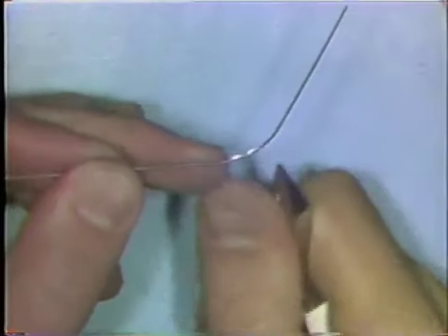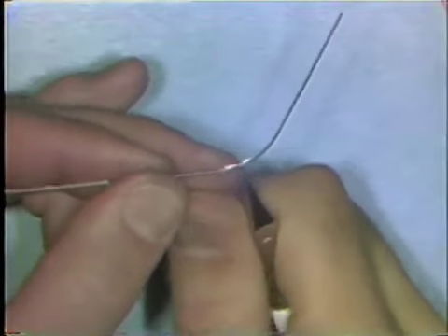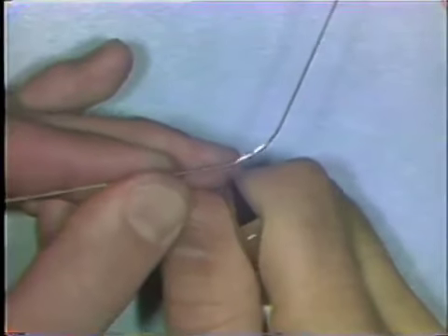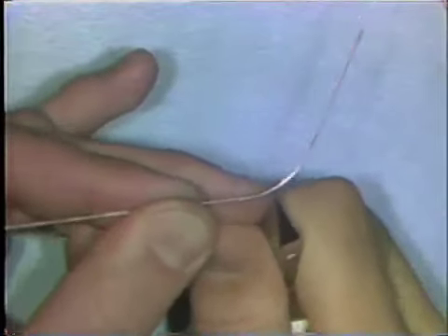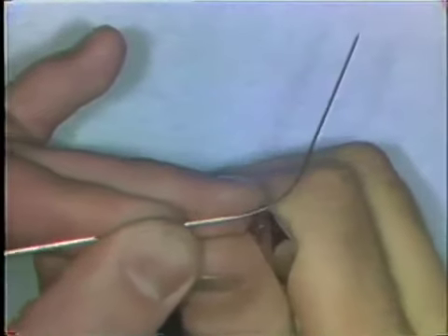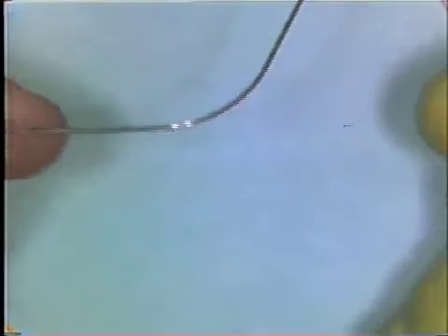To increase the curvature in an area that's been flattened too much — there's curvature here and curvature here but a little flat section right through there — you place the wire back in the beaks of the plier and make two or three small bends very close together. And this will take care of those overly flat areas.